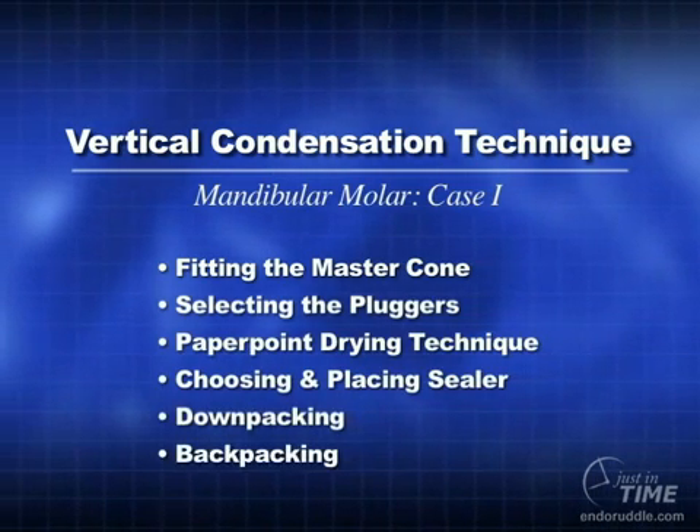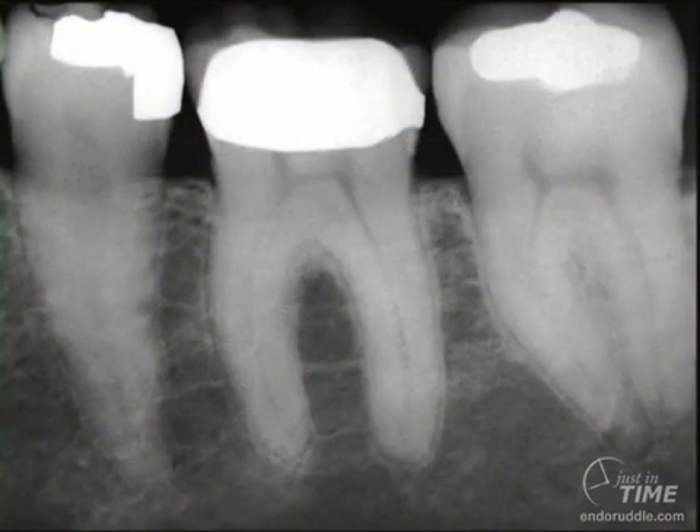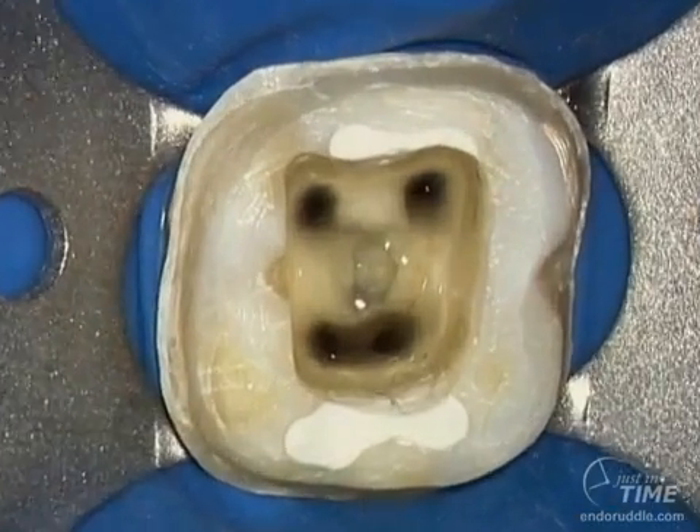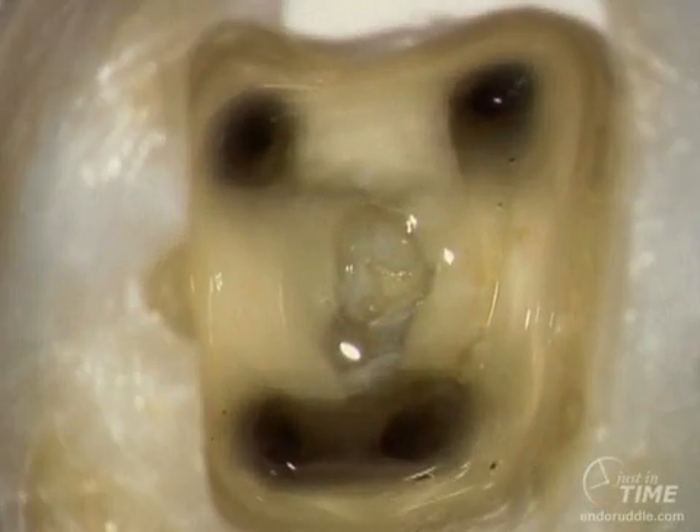Let's look at the Warm Gutta Percha with vertical condensation technique in one of the mesial systems of this mandibular first molar. The clinical crown was removed with the metal lift instrument. Looking at the isolated tooth, you can see that we've shaped all the systems.